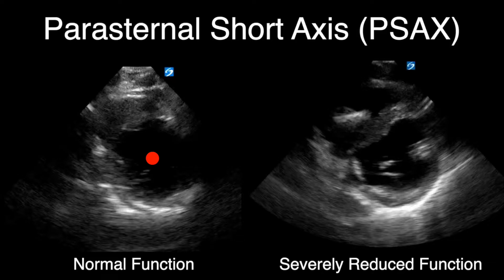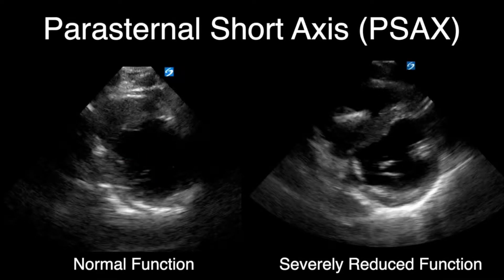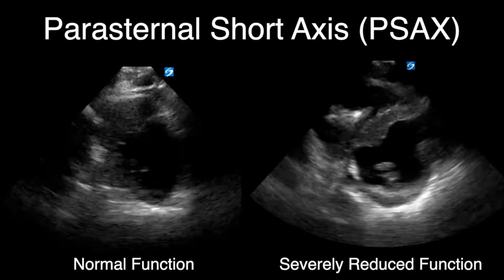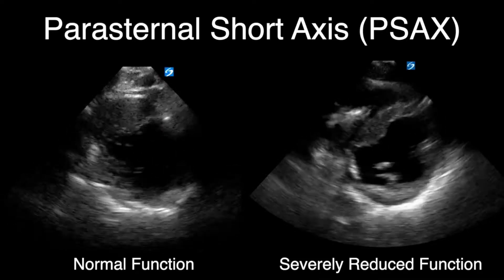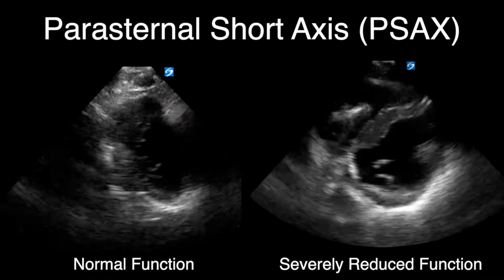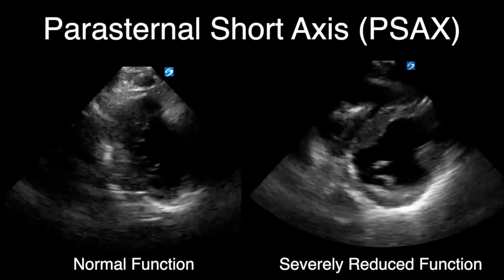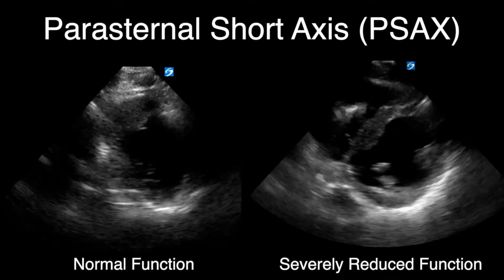The walls do not need to touch — that would imply an ejection fraction of 100%. Normal is approximately 50-55%. In the normal function example we see good wall collapse toward the center. In the severely reduced example the left ventricle is not collapsing well and the myocardium is not moving toward the center. Also visible here is a pacemaker lead within the right ventricle — we're focusing on the left ventricular wall.